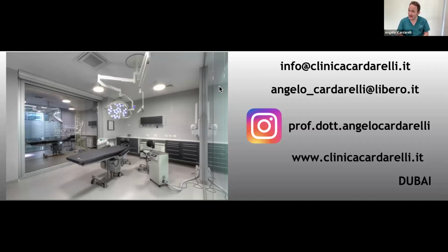And why long implants, especially in the posterior? Because, as you know, in the maxilla, I need to achieve bicorticalism and primary stability. So with the posterior implant, with the length of the implant, I need to achieve primary stability here on the nasal basal bone, where the quality of bone is very high.